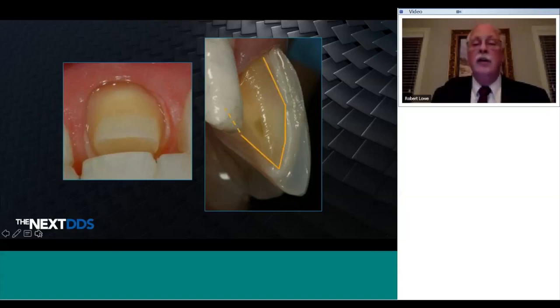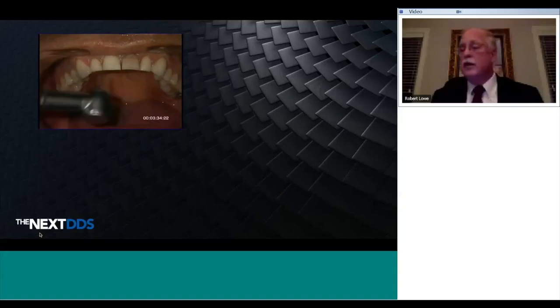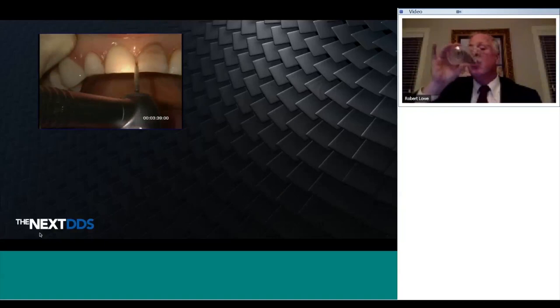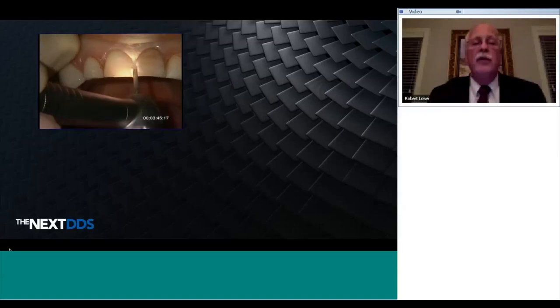Following the reduction step. I'm going to show a couple of videos right here, just a couple of seconds. We're into the 9:35 here. We've got about another 10 minutes. But just to show the burr moving, I'm breaking contact. It's the first thing I do when prepping multiple teeth.